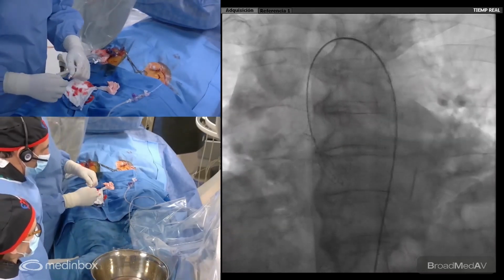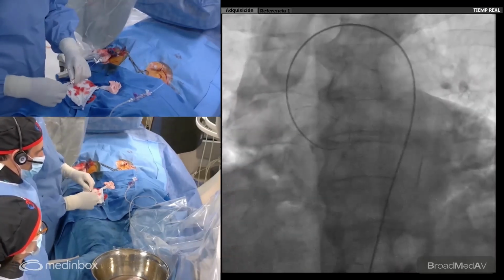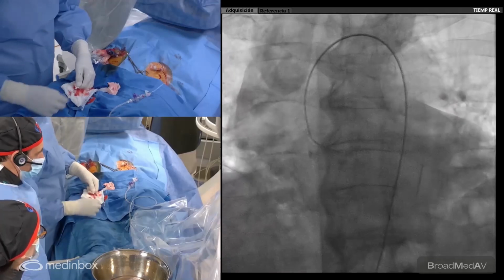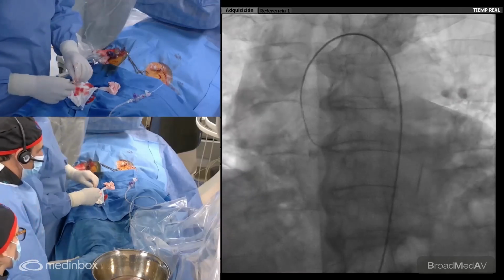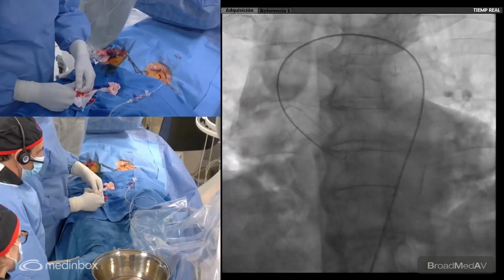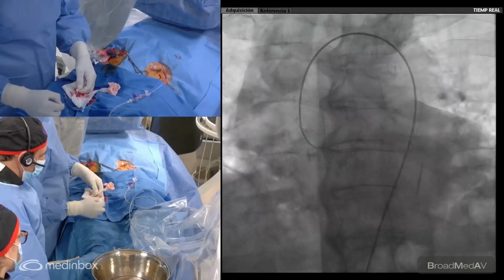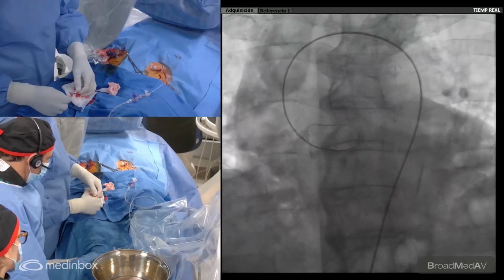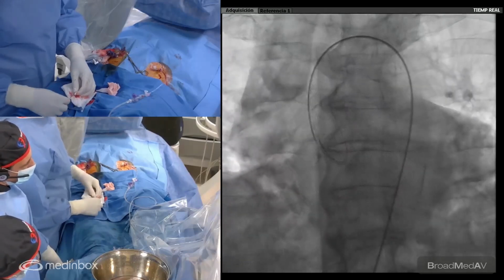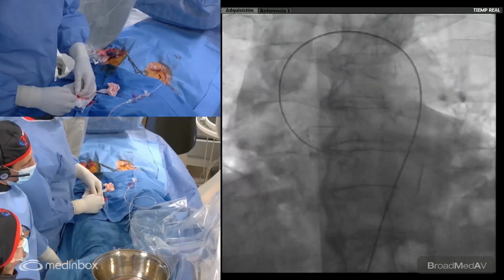So you see, it's not that easy to see due to the morbid obesity, such a huge thorax. So we tried like this for some minutes. We have time today. In most of the cases we can, or it's not the day. Give me some minutes. Why can I try this? Because I'm not doing any other movement, because this wire is not traumatic.